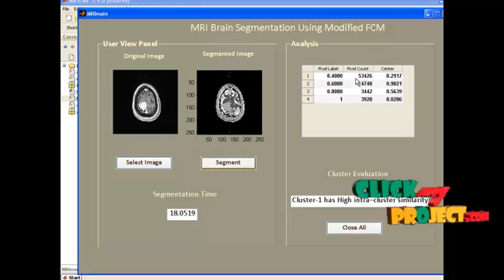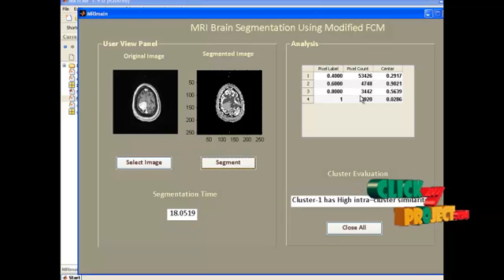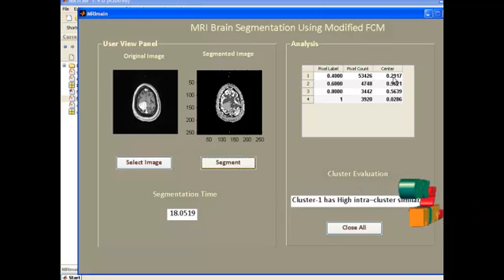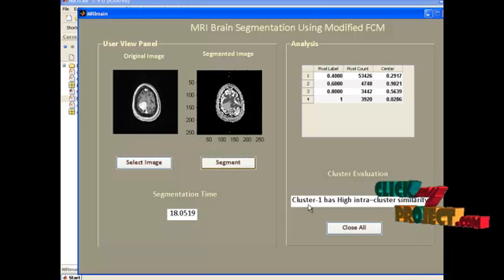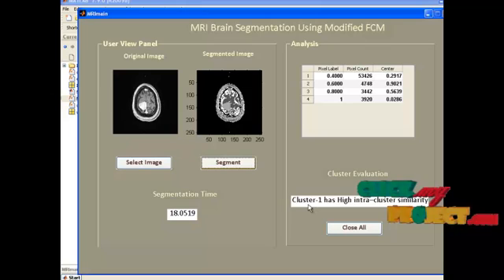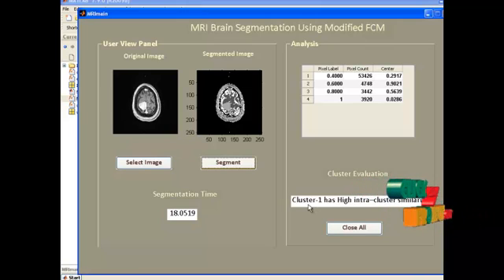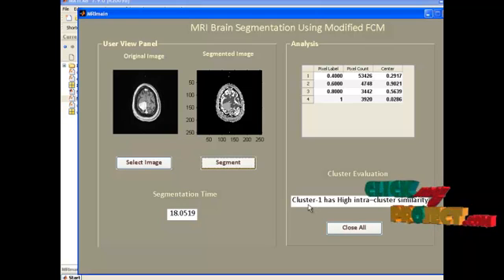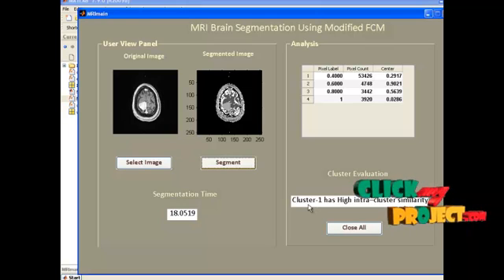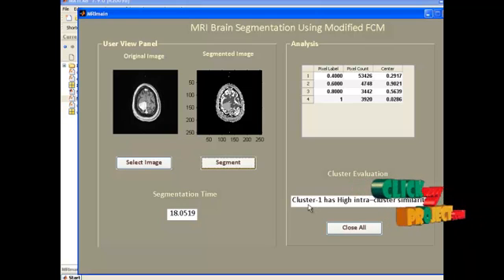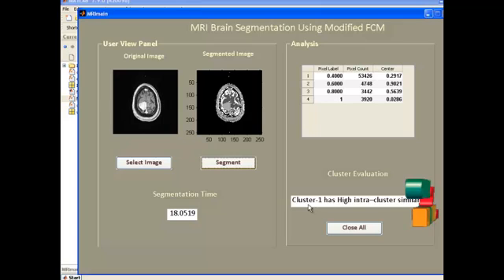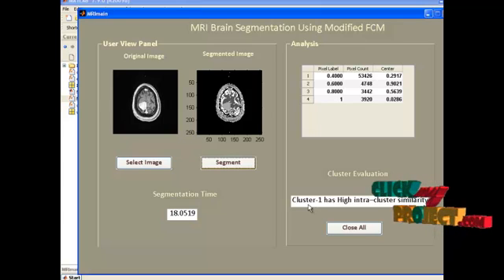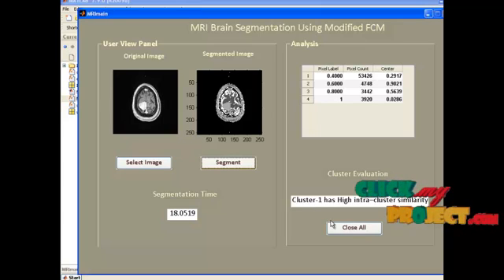The table column shows the pixel label, corresponding pixel count, and the centroid value. Among the four clusters, Cluster 1 has the highest intracluster similarity. By viewing all these results, we can assuredly conclude that our system has reached the best performance when compared to existing systems.